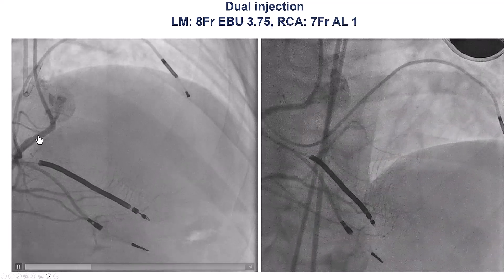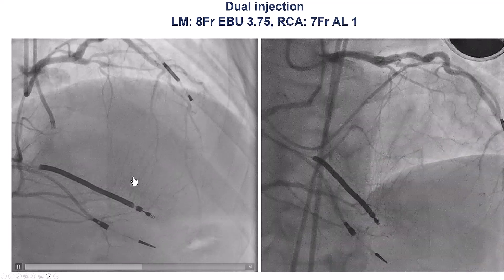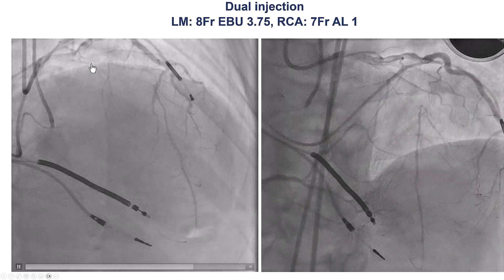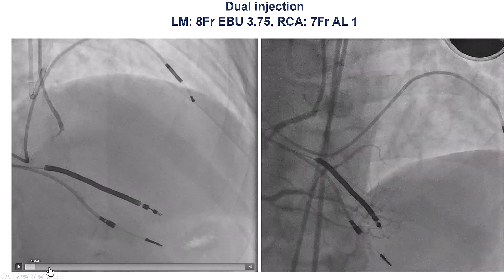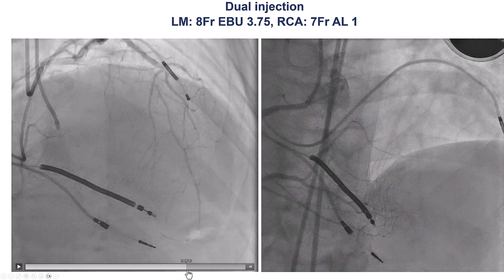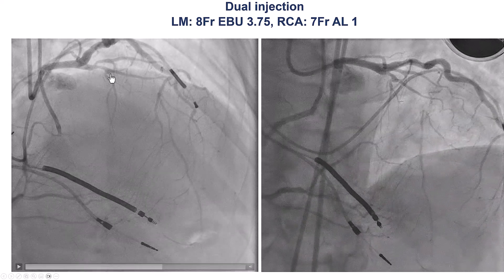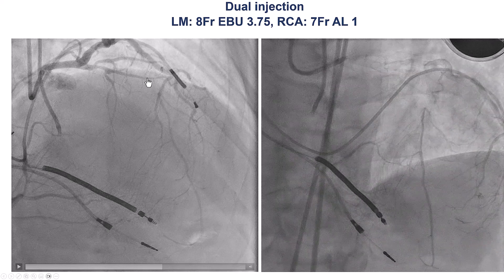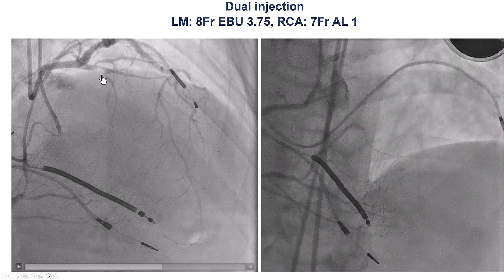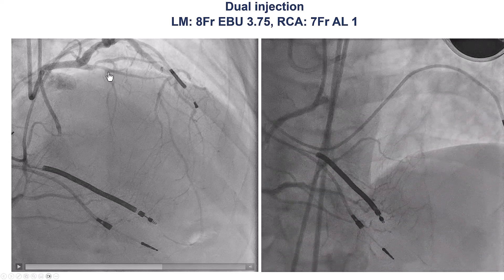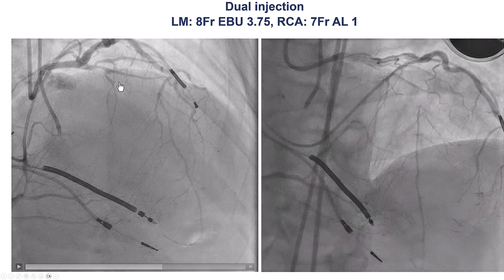This is a dual injection, injecting from the right coronary artery, with filling of the LAD through septal collaterals, and this is the antegrade injection. What we can see is that the proximal cap is at the takeoff of a diagonal branch in the septal, and there is some ambiguity — it's hard to know exactly where the vessel is continuing.